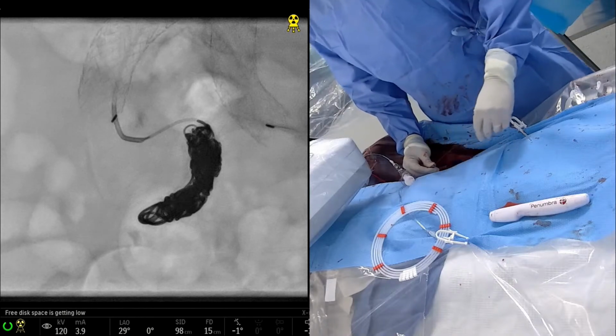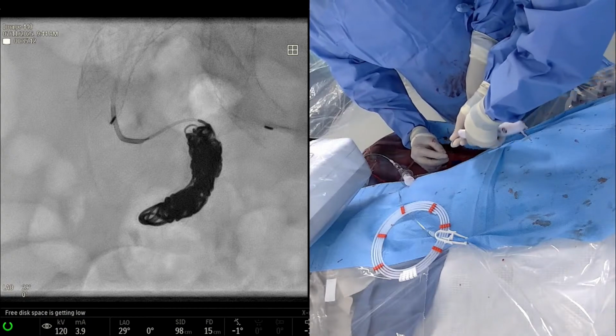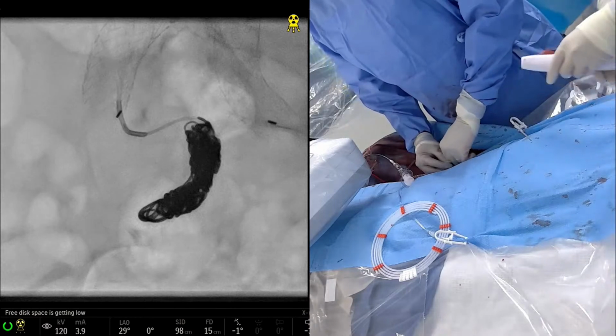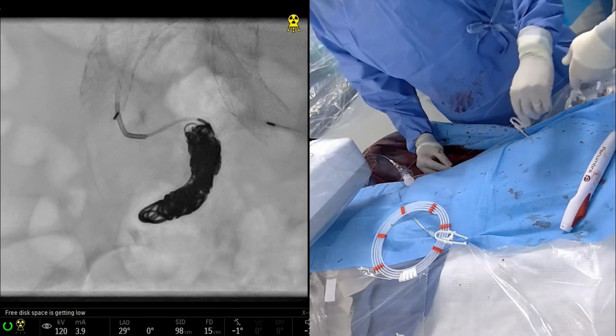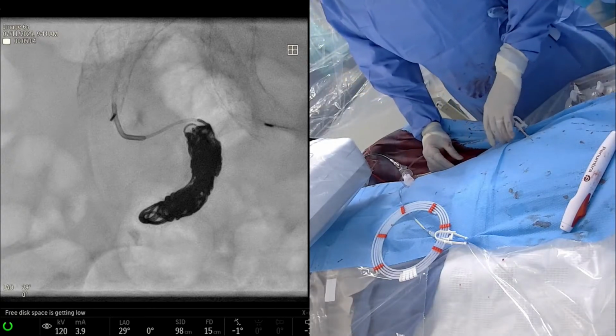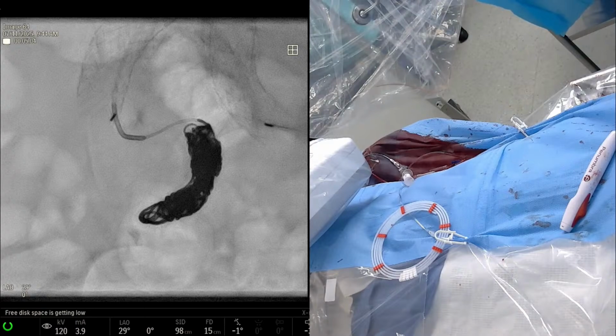So there's the dash. We'll use the detachment mechanism again. All right. You're right, the volumetric analysis can be tricky. I think there's a tool you can utilize to guide you to identify packing density online. Something to consider.